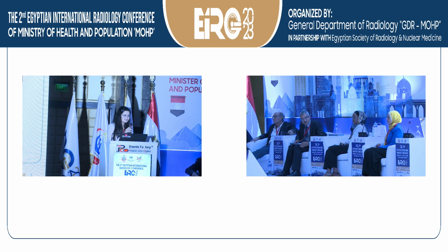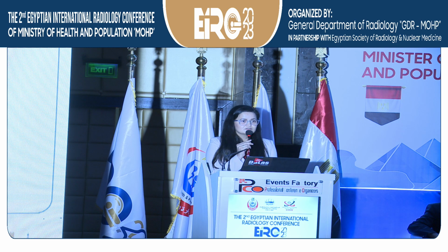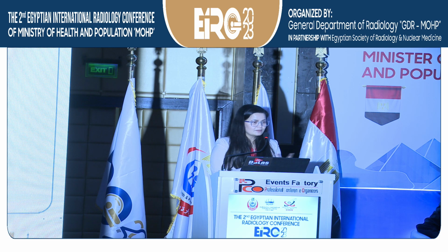I ask about fatty liver being transformed to cirrhosis or fibrosis. It depends on the degree of steatosis and what percentage of patients with fatty liver are transformed to cirrhosis. Okay, doctor, some patients look like very grade 3 fatty liver, you don't see the diaphragm and so on. But when you combine UDFF, it will show you that maybe there is a significant fat around say 16%, but when you do a fibrosis assessment, it shows you a very high number, which tells you that it is not fatty, but it's going into fibrosis.